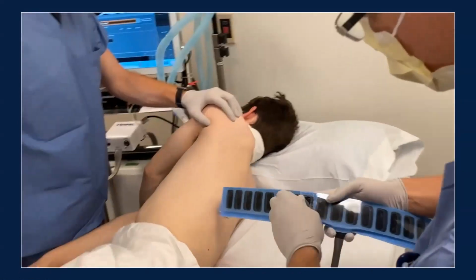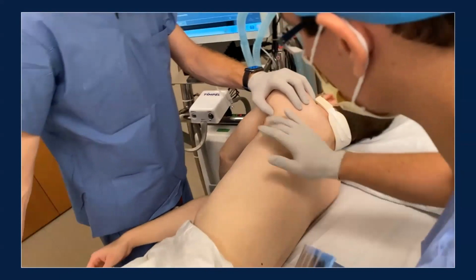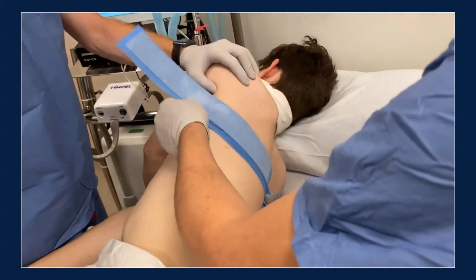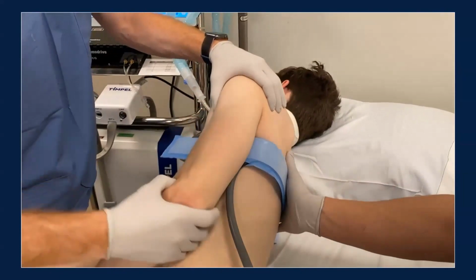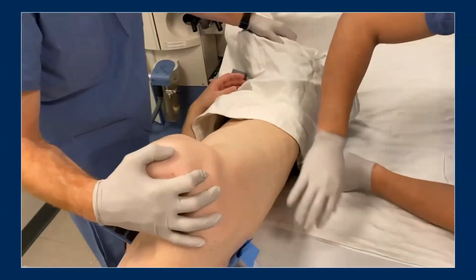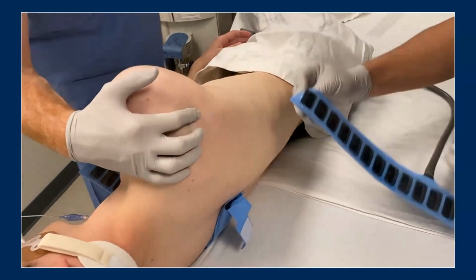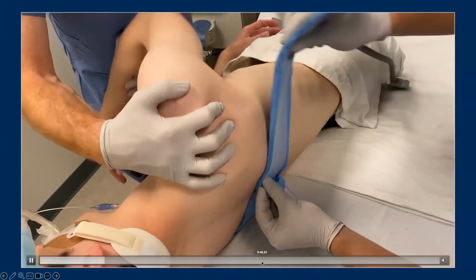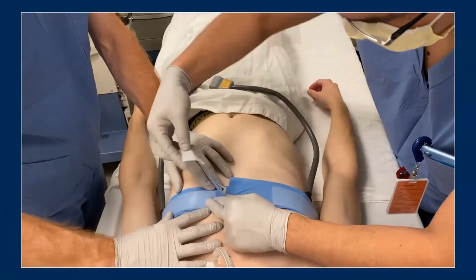We prefer to place a patient on one side, generally the left side up first, and then we attach the electrodes starting at the backbone and keeping the electrodes aligned in the fifth to sixth intercostal space from the parasternal area. Then we flip the patient to the other side, and we can fix the remaining electrodes in the right thorax. And once we are done with this, we are ready to start the monitoring process.